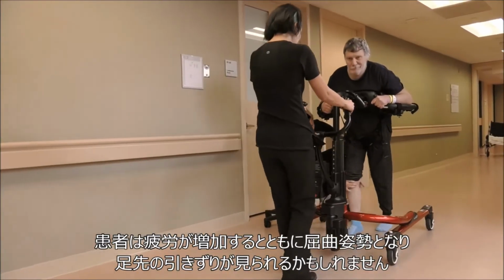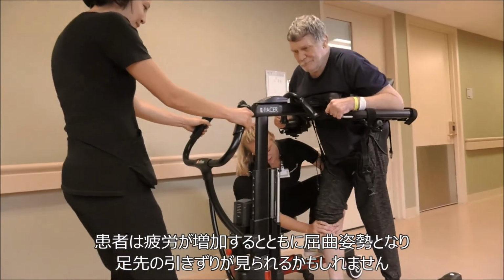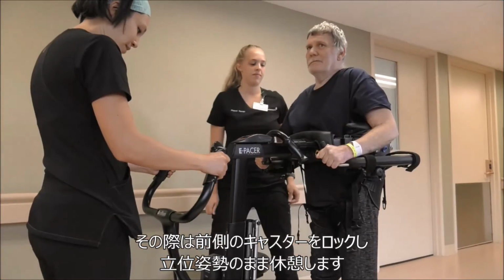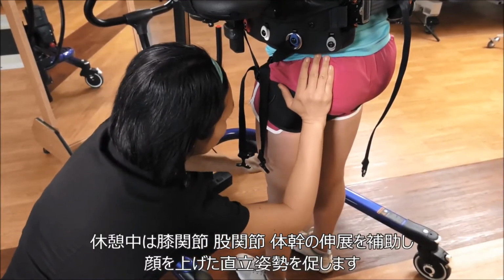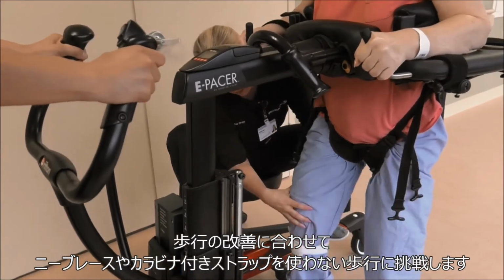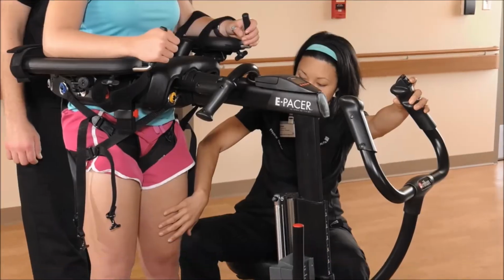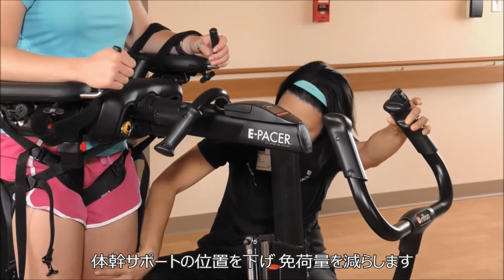As a patient fatigues, his posture may become more flexed and foot drag may increase. When this is noted, lock the front brakes and have the patient take a standing rest break. Facilitate knee, hip, and trunk extension during rest breaks, encouraging the patient to stand tall and stretch. As a patient progresses, trial gait without the knee brace or Husky hang-all. Decrease body weight support as tolerated by lowering the body support slightly.